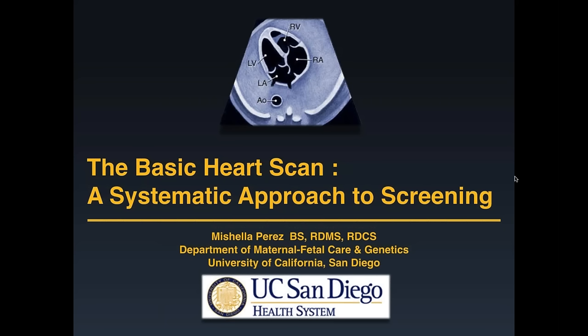Oh, there's one more. Is there any specific distance between the tricuspid valve and mitral valve used for Ebstein anomaly? That is a very good question. I think I asked a pediatric cardiologist that same question one time. I know that there are papers out there in terms of a specific distance. I don't have that in mind right now, but I know there is a paper out there. If you could leave me your email, I could email you back with more of the information. But I believe that just by eyeballing, the tricuspid valve is slightly more apical, but if there's an exaggerated distance between the mitral valve and the tricuspid valve, then that should be concerning.